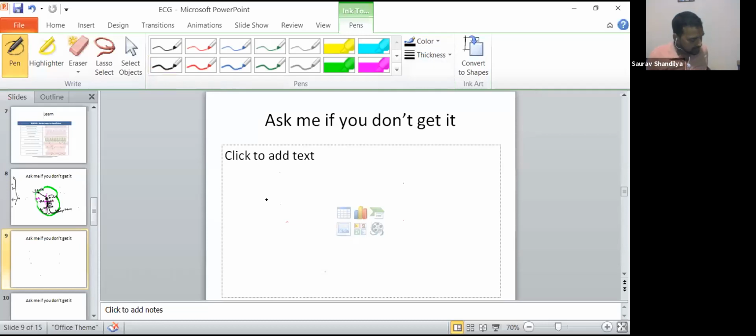Yeah. So for the P wave, I will draw again the heart of my choice, because I want you to see what exactly happens in the heart. I want you to believe me. We'll be talking about lead 2 right now, and I want you to trust me about it.